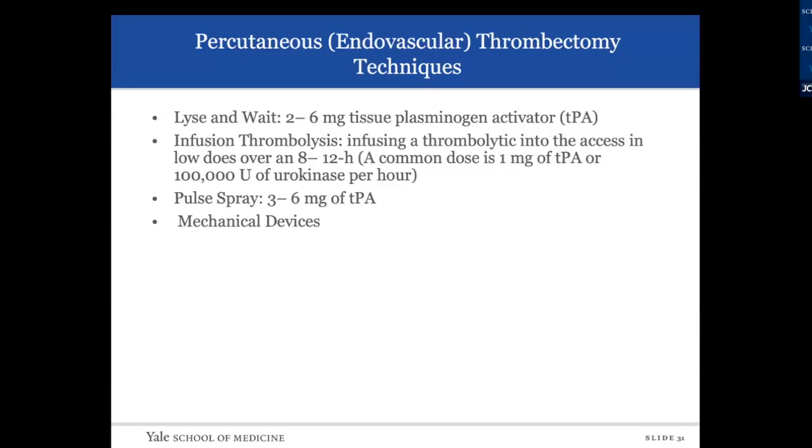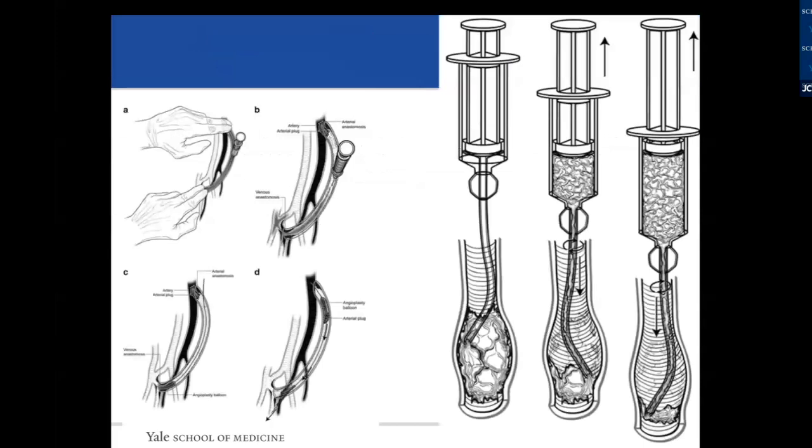That's the way that I was taught, and I have no problems. 95% of the time, those fistulas open pretty easily after you do the TPA and crush the clot with a balloon. I have friends in dialysis access who just aspirate and angioplasty, and some of them don't even use TPA or heparin. So there are different ways to actually decrease the clot.